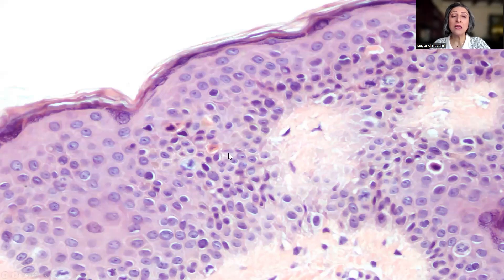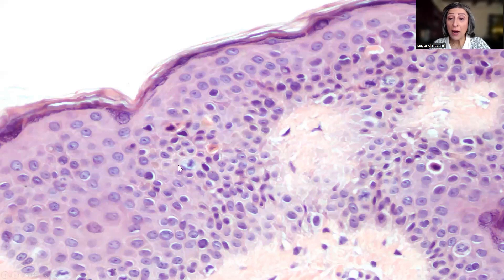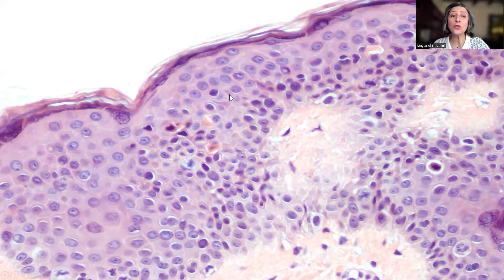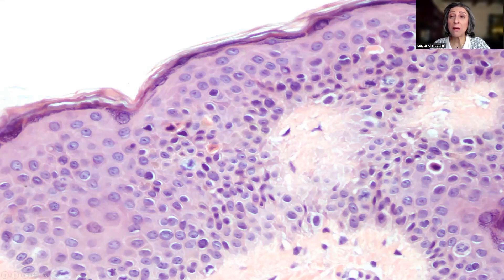And here is another focus, which really has most of the features — several dyskeratotic keratinocytes present, mitotic activity, another dyskeratotic keratinocyte, and another one. So once you pick up one of the dyskeratotic keratinocytes, you will start seeing them, and sometimes in aggregates. This is associated with some maturation disruption in the epidermis.